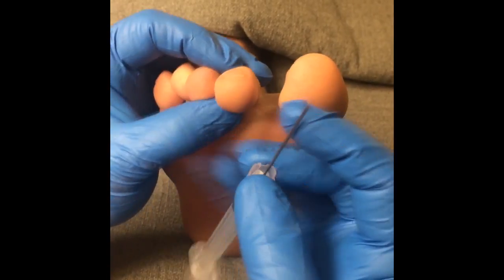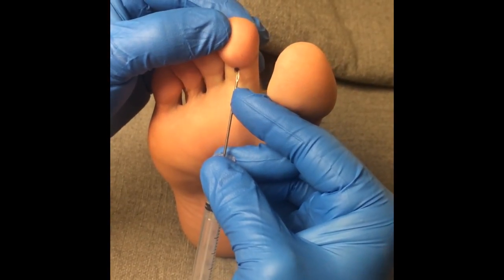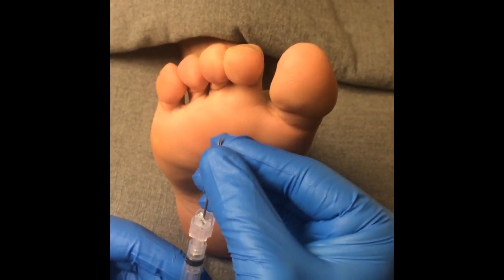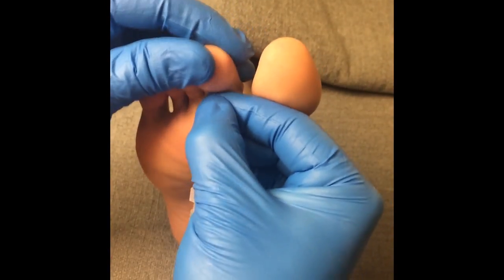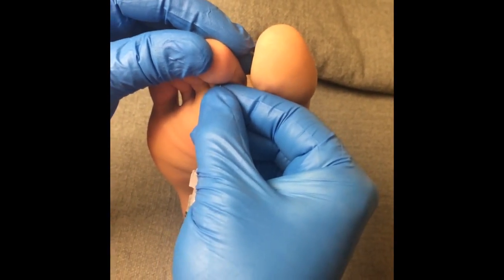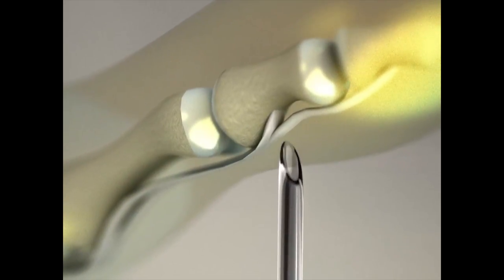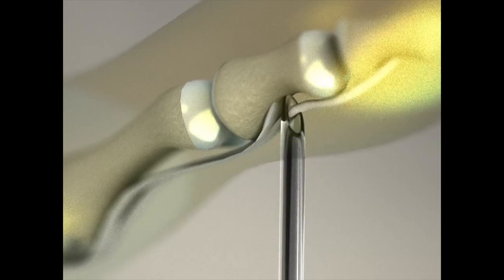Controlled grip of the instrument is essential in minimizing collateral tissue damage and maintaining a small percutaneous incision. Choking up on the needle may prove useful for weak material properties or wet gloves. The landmark for placement is distal to the flexor digitorum brevis insertion at the base of the middle phalanx, without involving the distal interphalangeal joint structures.